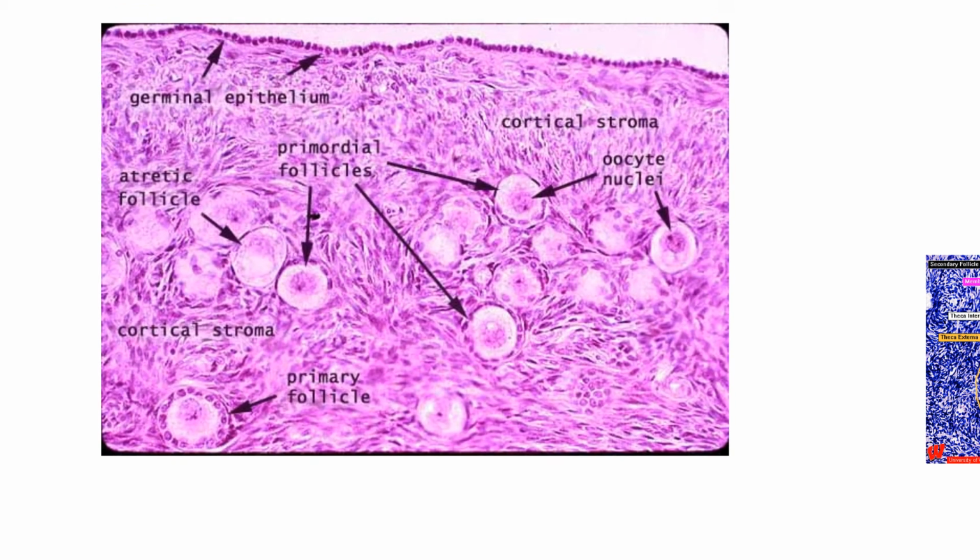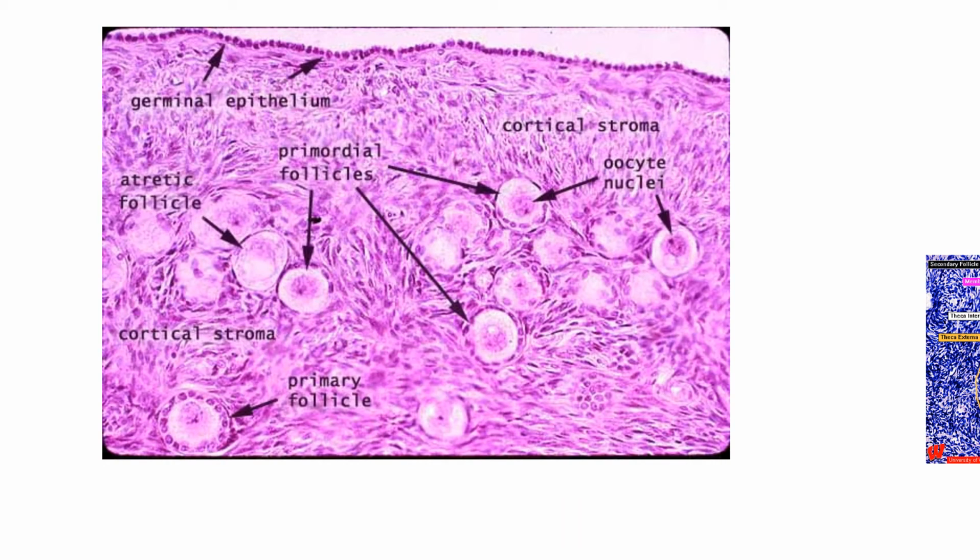Excellent pictures. Okay, now we're going to look at some sections of tissue at much higher magnification. So we're going to see a smaller area, but we're going to get closer. I found this one that talks about several things, and it's got labels, which is always nice. Up on top, this is the edge of the ovary. So here, where I'm going back and forth with the red laser pointer, would be air or abdominal cavity, let's put it that way. Not air, but once you section it, there's air out here because you take the ovaries out.